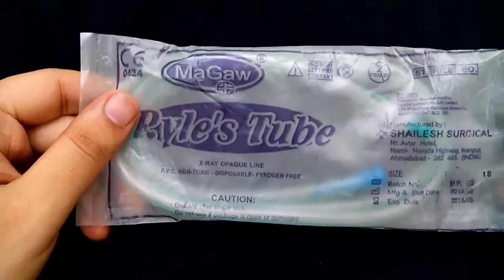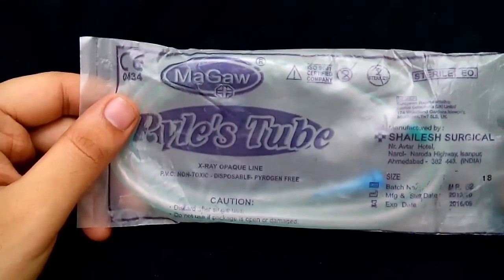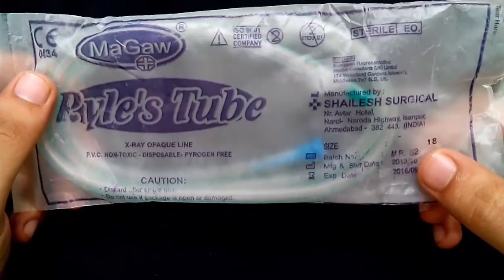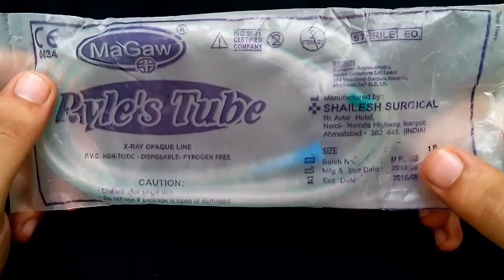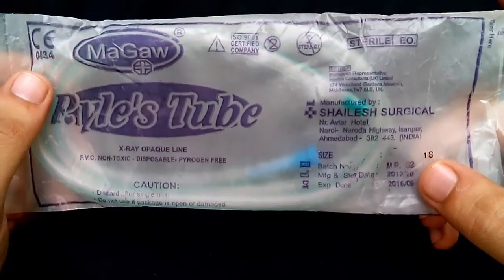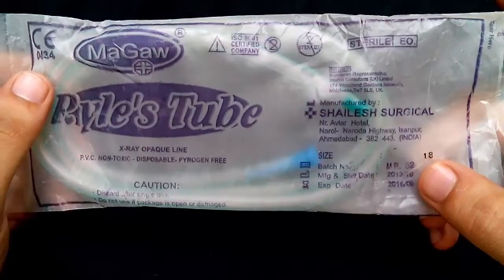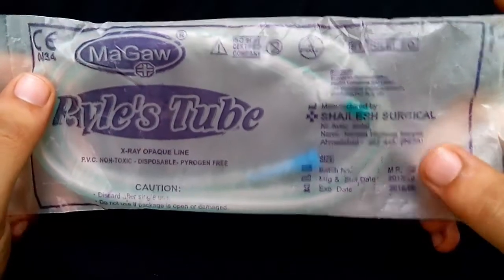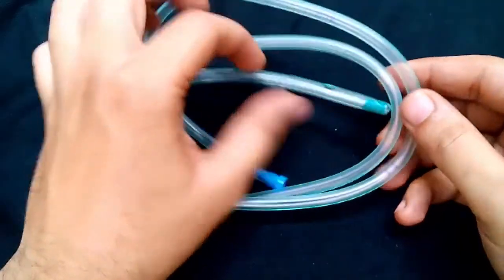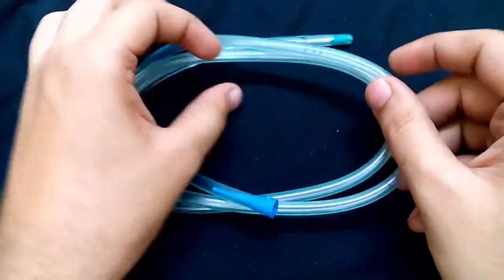The standard length of the Riles tube ranges from 105 to 120 cm. There are different sizes of Riles tube ranging from 10 French to 20 French. This one is an 18 French Riles tube, which means the diameter would be 6 mm, since 3 French is equal to 1 mm — so 18 French equals 6 mm diameter.